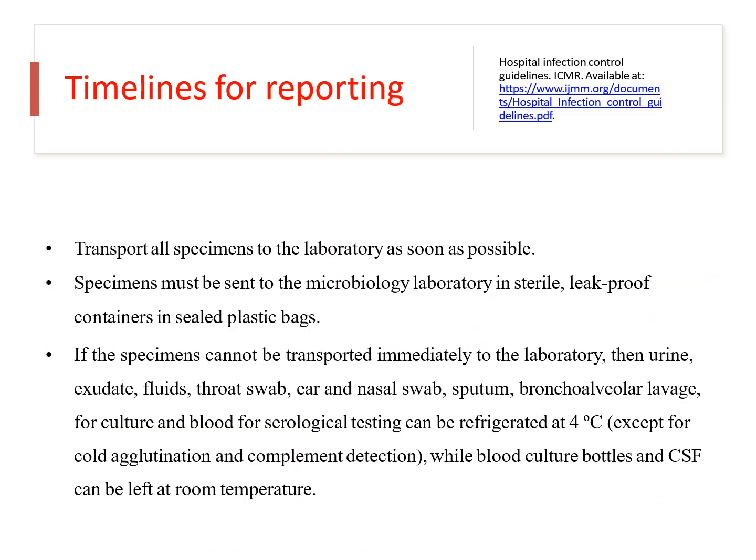That was some of the guidelines for processing samples like blood and CSF. Transport all specimens to the laboratory as soon as possible. The specimen must reach the laboratory within 2 to 4 hours of collection, and they should be transported in leak-proof containers and sealed plastic bags. If the specimen cannot be transported immediately to the microbiology laboratory, then refrigerate it at 2 to 8 degrees Celsius, except for blood and CSF, which need to be kept at room temperature.